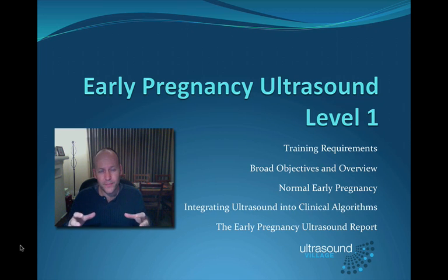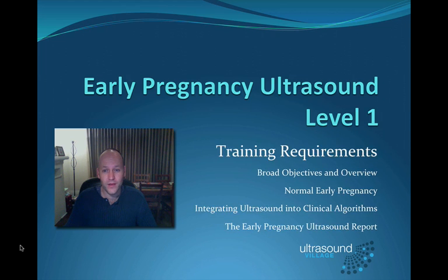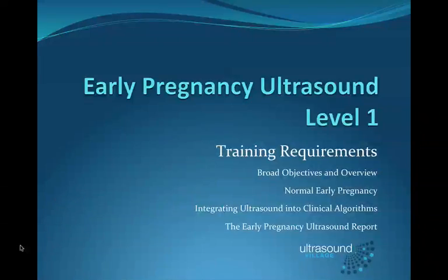We've all got clinical algorithms in our head, how we manage patients in early pregnancy. At the moment, any pregnancy problem gets a formal ultrasound or referral to an obstetrician generally. But this lecture is about integrating basic ultrasound knowledge into your clinical assessment, and that's what that section of this lecture is on. And finally, we're going to go through the early pregnancy ultrasound report, which is a pre-formatted report that you can use to help practice ultrasound safely in your practice. So let's start with the training requirements.